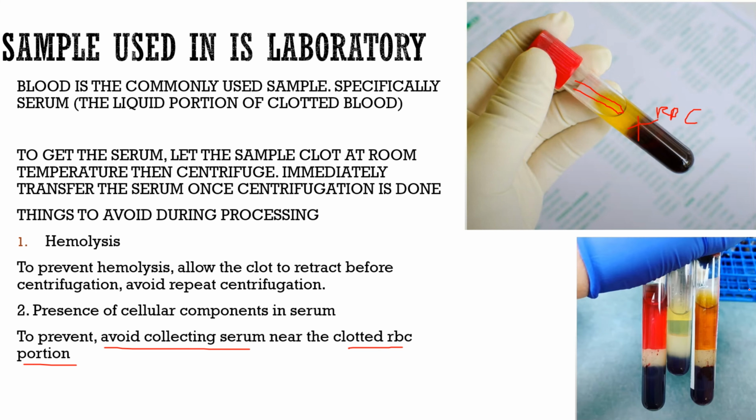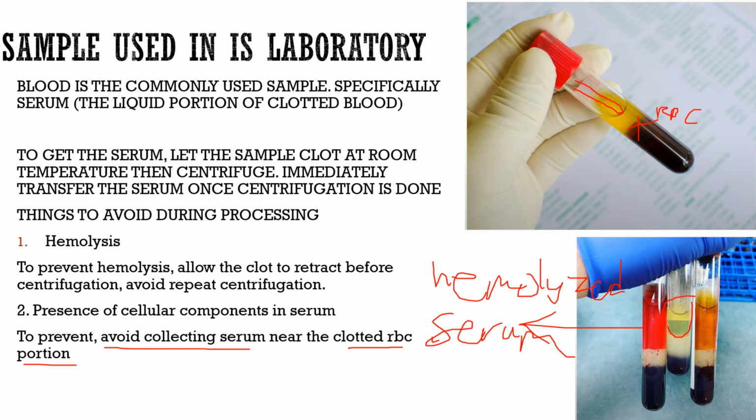So, take a look at these pictures, class. Ito yung mga different samples na pwede mong ma-encounter. This is an example of a hemolyzed serum. And ito yung normal appearance ng serum, class. Ang pangit lang, this is a very terrible sample for me kasi may lipemia siya. May lipemic layer. So as much as possible, avoid the lipemic. Meaning nito na kulang to sa pag-stand. This was not allowed to stand long enough.